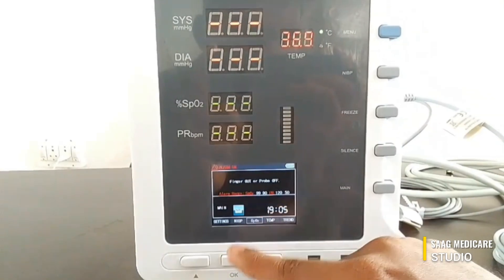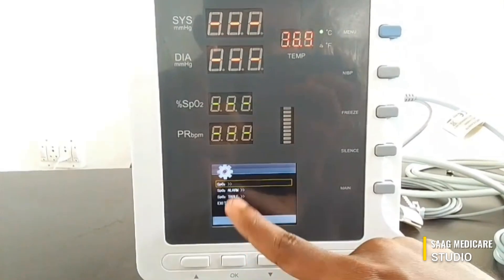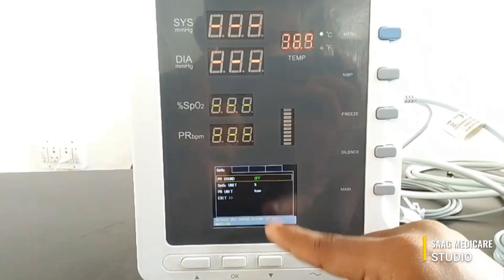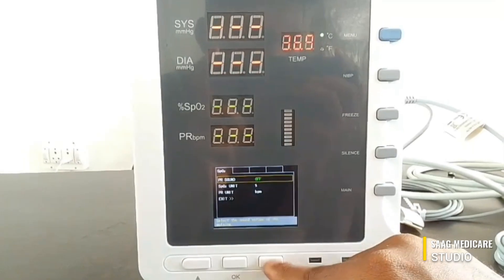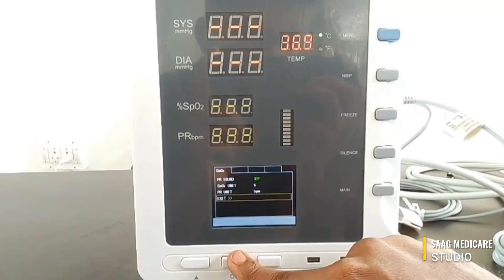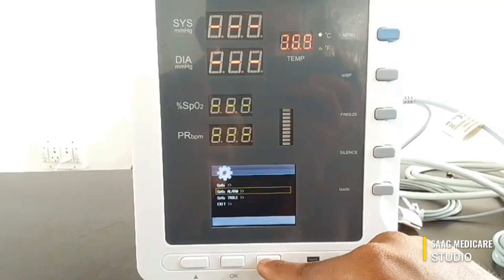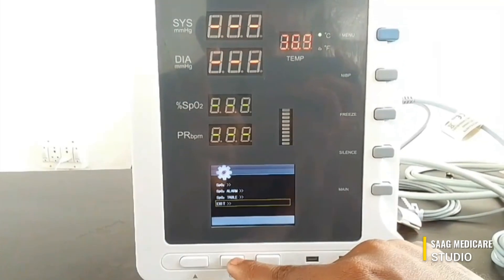You can also enter the SpO2 menu. In SpO2 you can set up your SpO2 settings, configure SpO2 alarms, and view the SpO2 table.